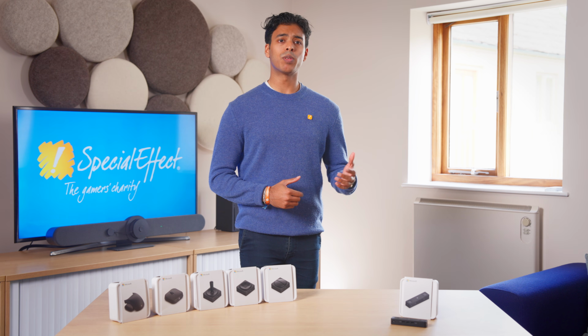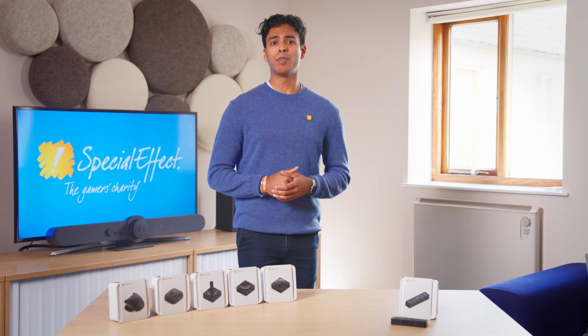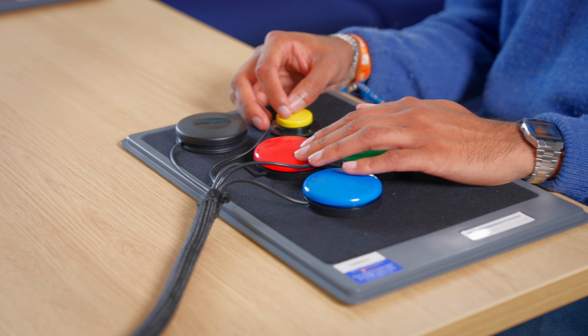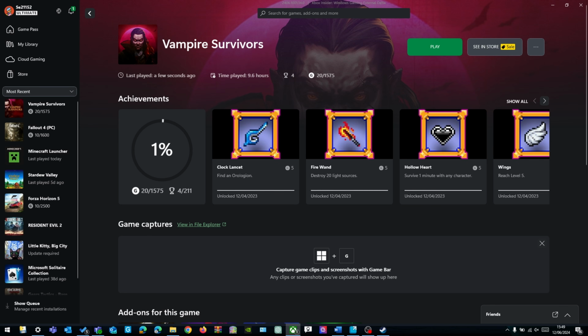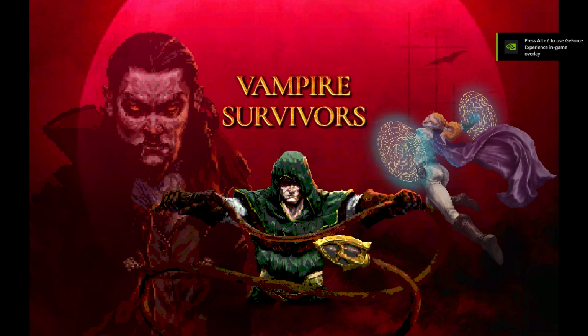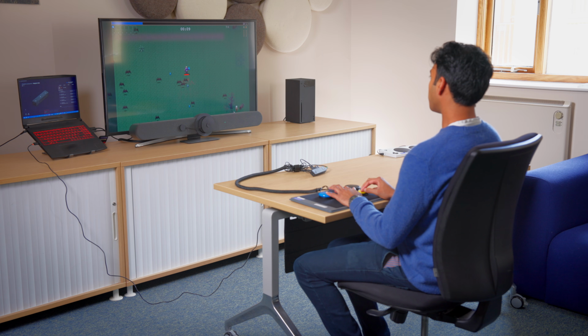App profiles are the same on all PCs that are used with your Adaptive Hub. This means that the apps will have the same profile when you use your Adaptive Hub with other PCs, but you will need to have the Microsoft Accessory Center app installed. As an example, you can see that these switches are set to output Windows shortcuts, such as opening up my game library or taking a screenshot. When it detects that Vampire Survivors is open, the hub automatically swaps the switch outputs to become the WASD keys that are needed for movement within this game.